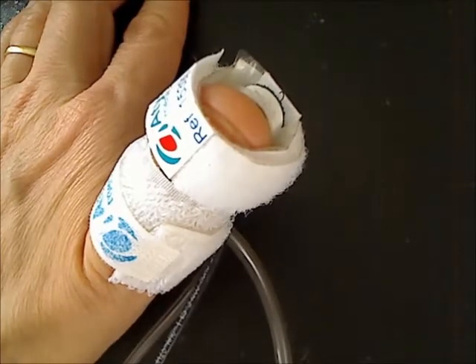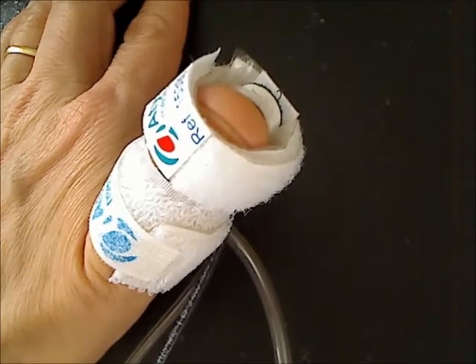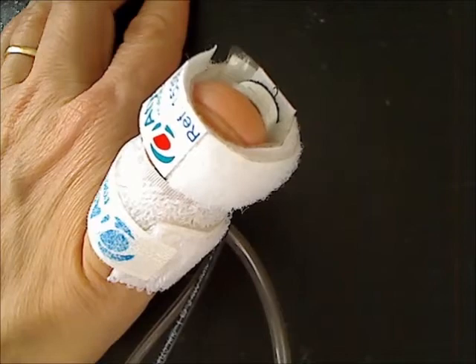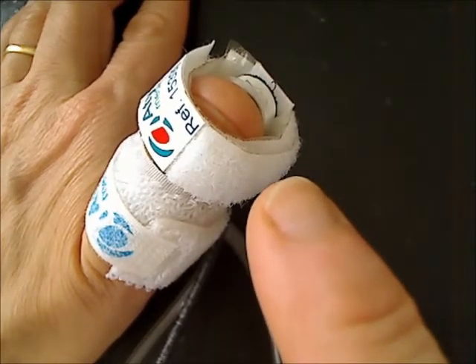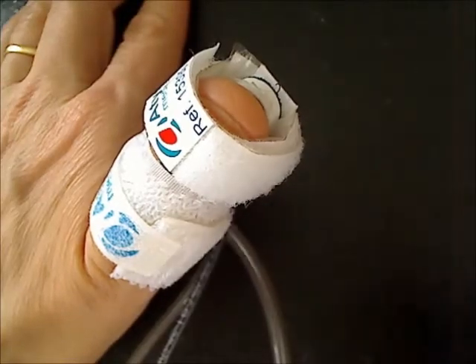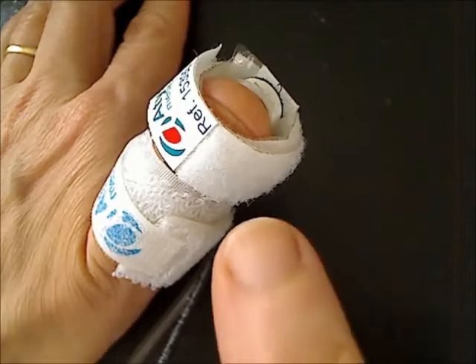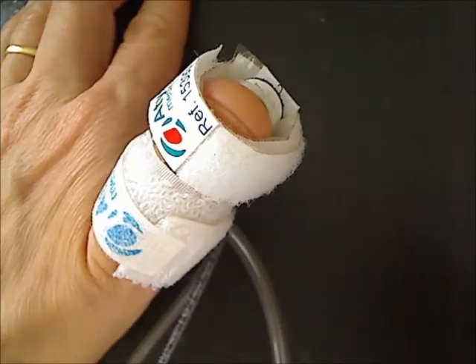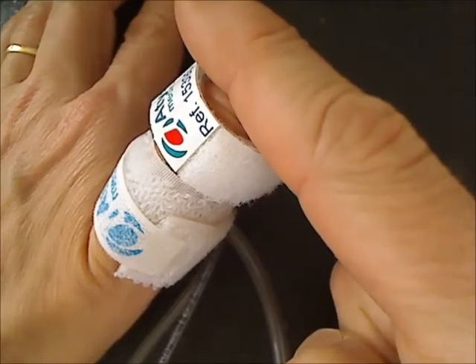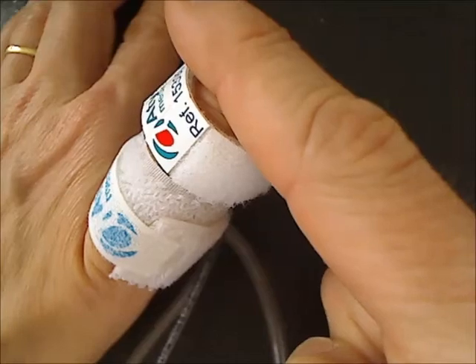Some patients may have toes with a strange shape, and because of the shape of the toe, the sensor cuff may slide away from the toe during its inflation. To prevent the cuff from sliding away during inflation, you can gently place your finger over the sensor cuff during its inflation.